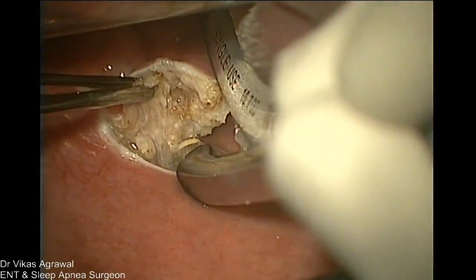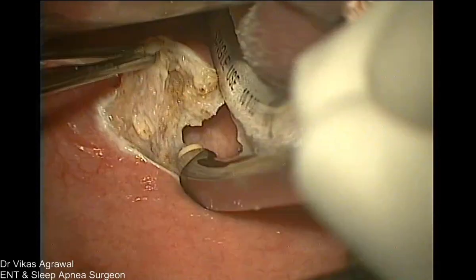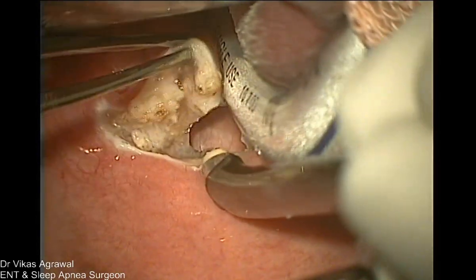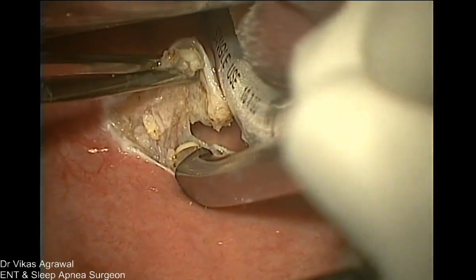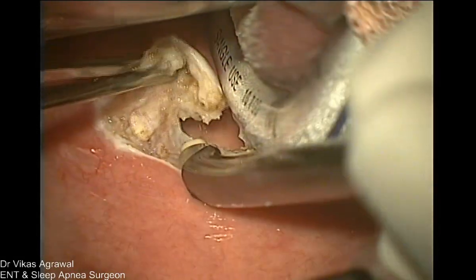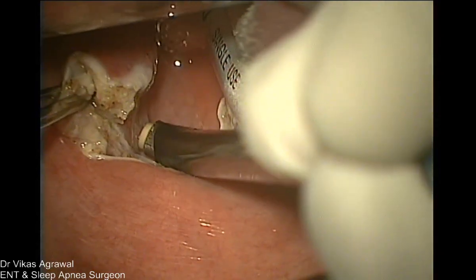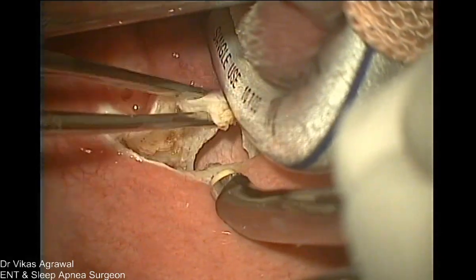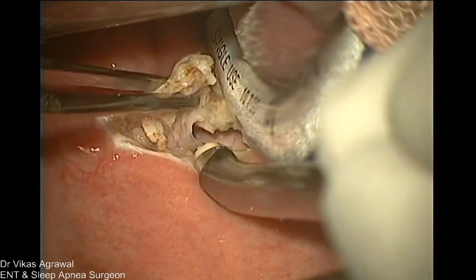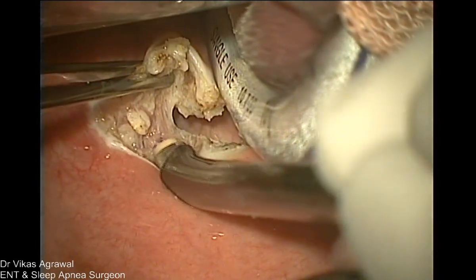Right. So I am cutting through the medial fibers of the palatopharyngeus muscle so that this part which was causing the AP collapse is gone. As we go more laterally, this is the pharyngeal wall. So this much part which I have cut was responsible for the AP collapse, and what I am going to cut now is responsible for the lateral collapse.